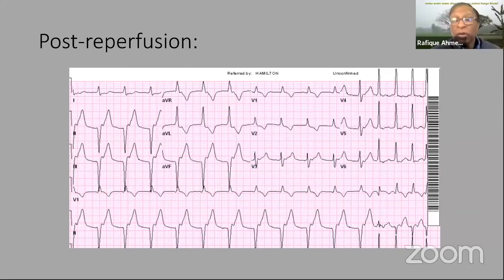Okay. So I think your answer is partially correct. You said concordance. You cannot say concordance from this ECG, because if you look at the chest leads, this ECG is a mixture of wide QRS and narrow QRS. If you look at the bottom strip, you will see that the initial complexes are wide QRS, so clearly those are ventricular beats. The rate is less than 100, so it does not fall into the classification of ventricular tachycardia. It doesn't fall into the classification of tachycardia. So it's a ventricular rhythm in the setting of what Hafiz mentioned, an intervention done on this patient. And then I'll let Hafiz take over from here.